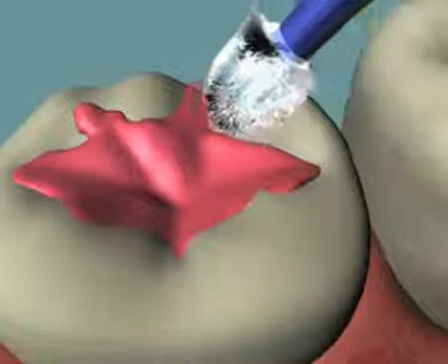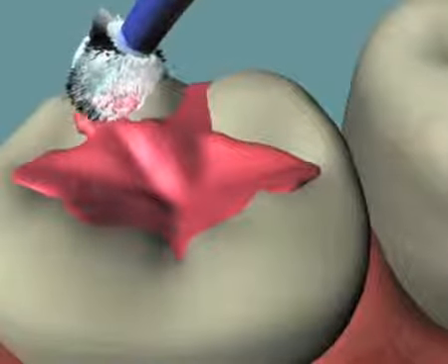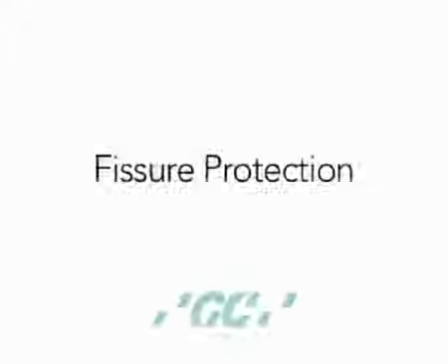These teeth are at their highest risk of caries during the 12 to 24-month period of eruption. This procedure, often undertaken in situations where moisture control is difficult, is called fissure protection.